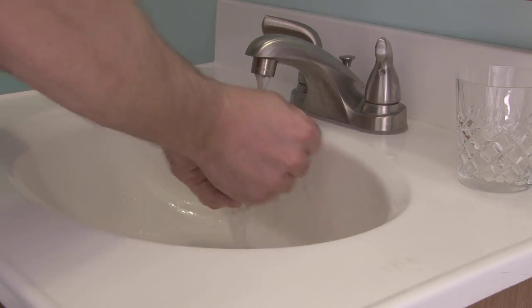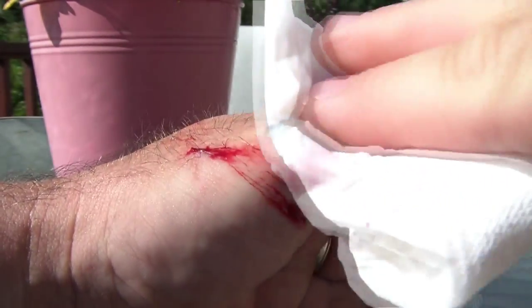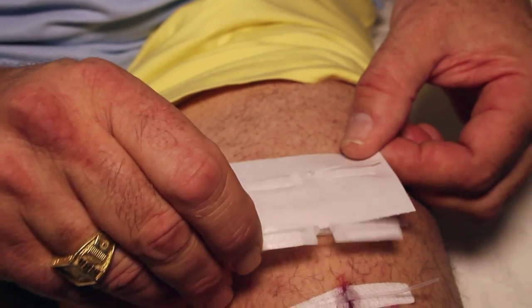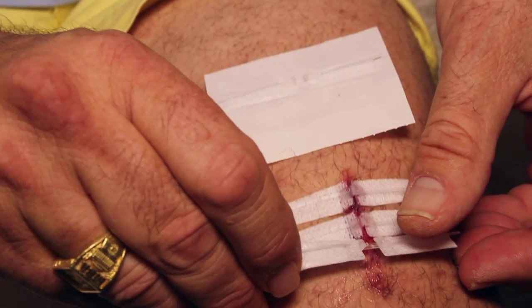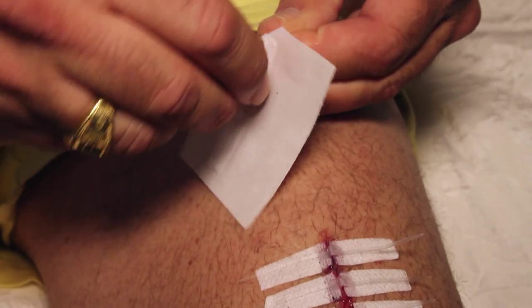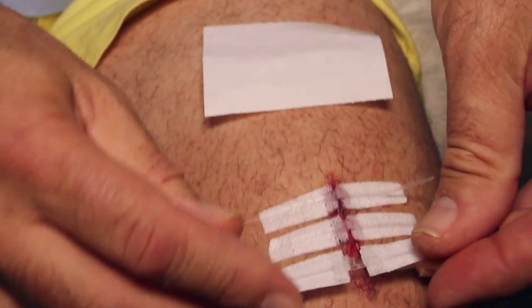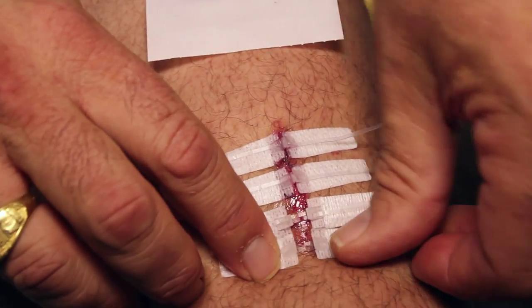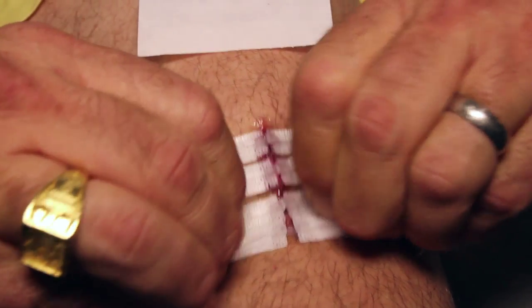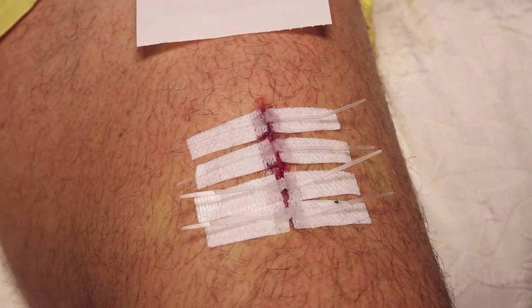Clean hands prior to use, then clean and dry the wound as directed. Remove the device from the package and carefully peel off the card, being careful not to touch the adhesive with fingers. Place the device on each side of the open wound — the wound should be in the center of the device. Press down on each side of the strip to activate the adhesive, then pull the tabs in opposite directions and watch how the skin is closed.